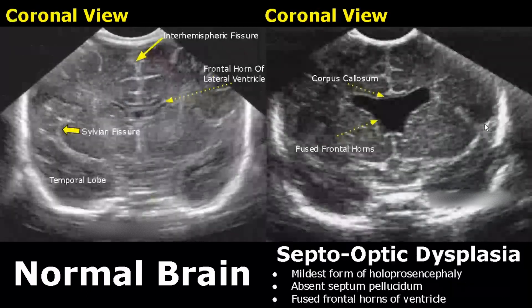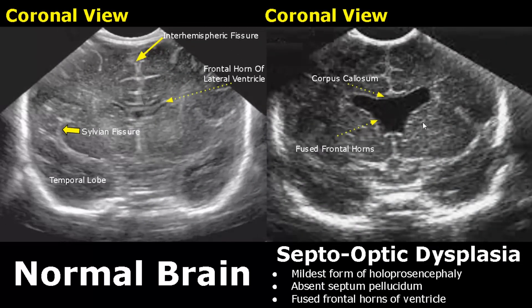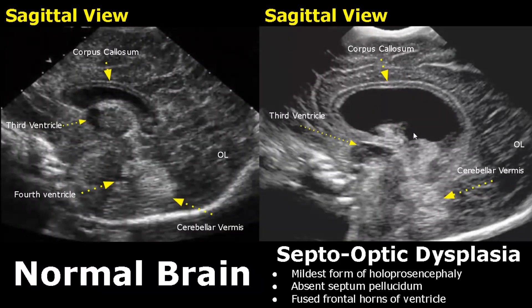Septo-optic dysplasia is the mildest form of holoprosencephaly, which has a series of brain abnormalities. In this form, the septum pellucidum is absent and we see fused frontal horns of the lateral ventricle — instead of two separate horns we see a large fused ventricle. In the sagittal view we only see a large ventricle; other structures seem normal.